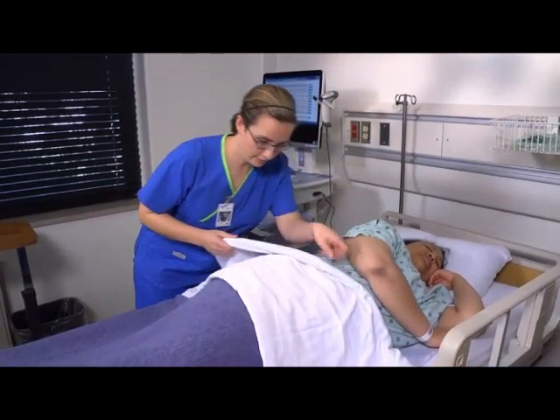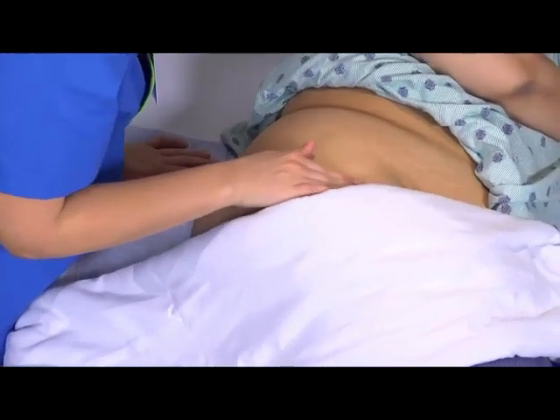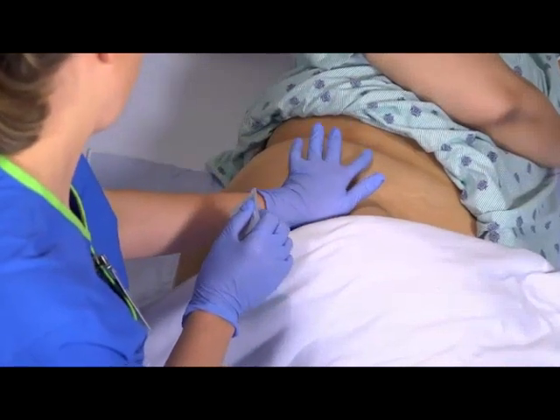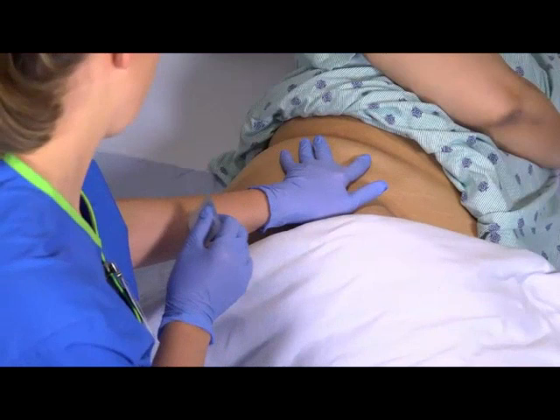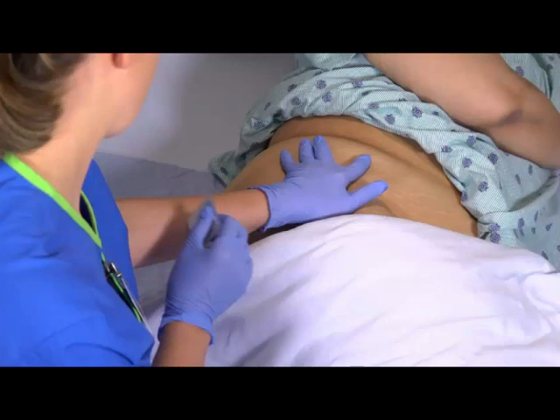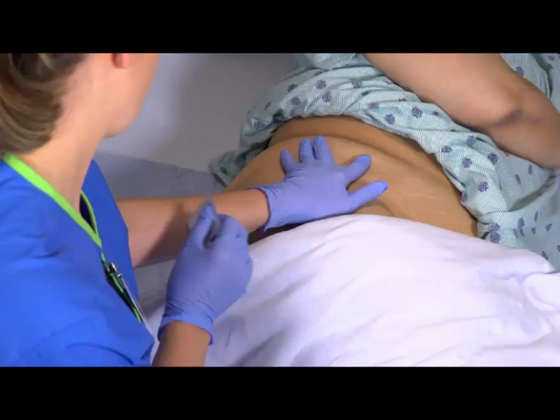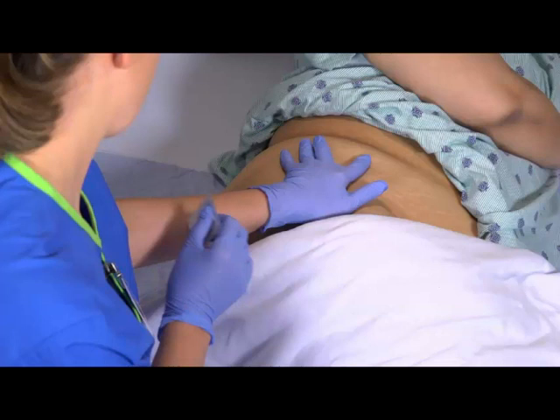Help the patient find a comfortable position that will accommodate the injection site you've chosen. Expose only that portion of the body. Apply clean gloves and use anatomical landmarks to find the site again. For a ventrogluteal injection, place the heel of your hand over the greater trochanter of the patient's hip, with the wrist almost perpendicular to the femur. Point the thumb toward the patient's groin, the index finger to the anterior superior iliac spine, and extend the middle finger back along the iliac crest toward the buttock. The index finger, middle finger, and iliac crest form a V-shaped triangle, and the injection site is the center of that triangle.